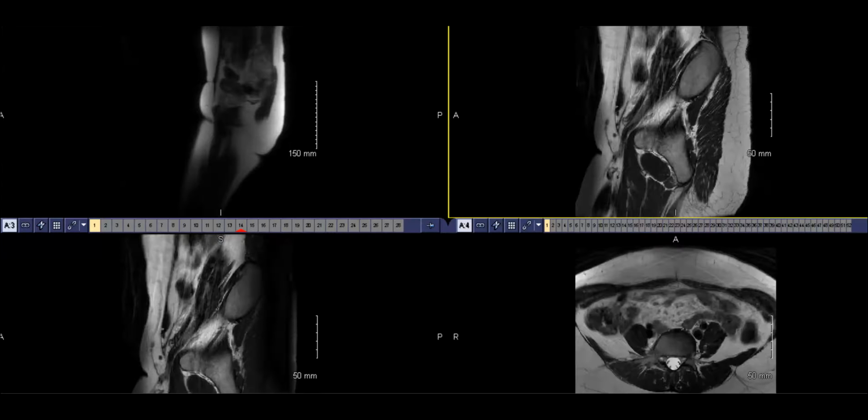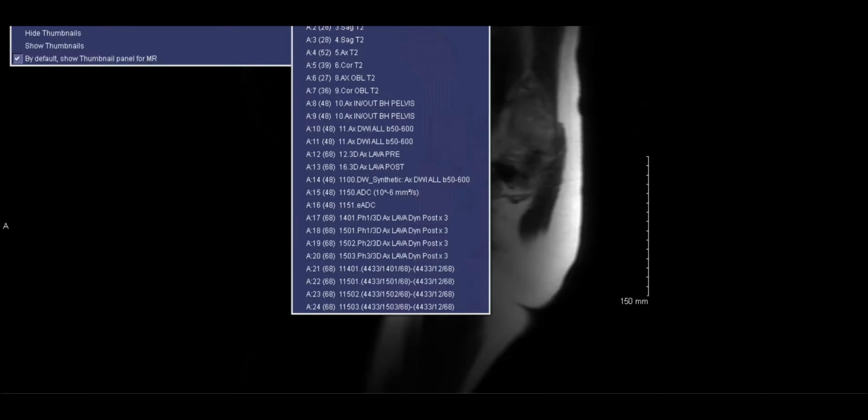So, all right, I'm going to stop as well as pause. Yeah. So I apologize for slowness because again, I'm sort of on a. Anyway, okay, so this is an interesting case.